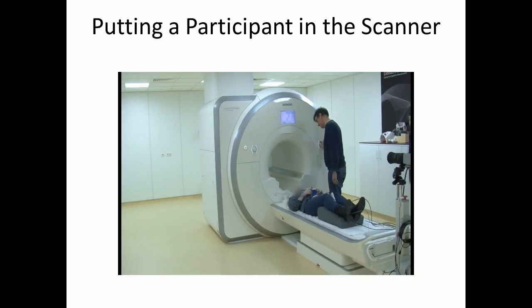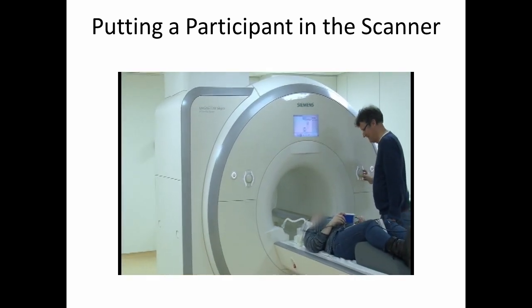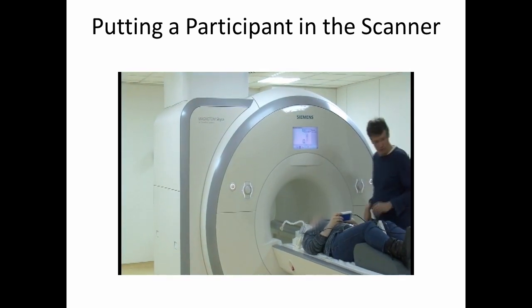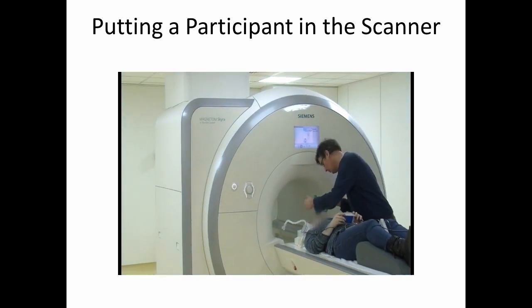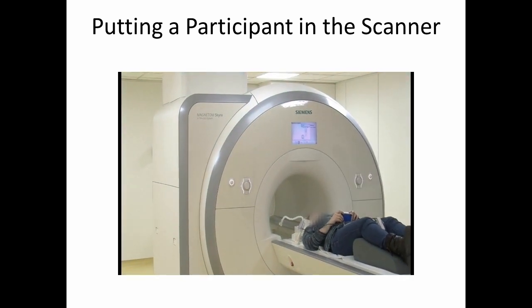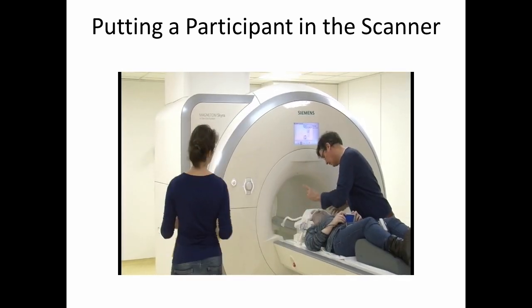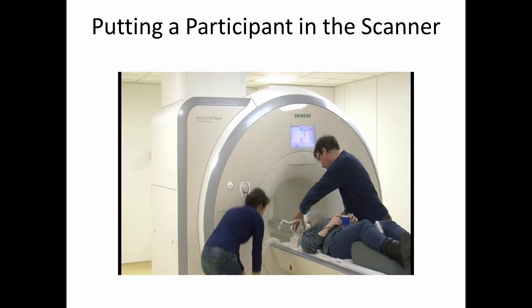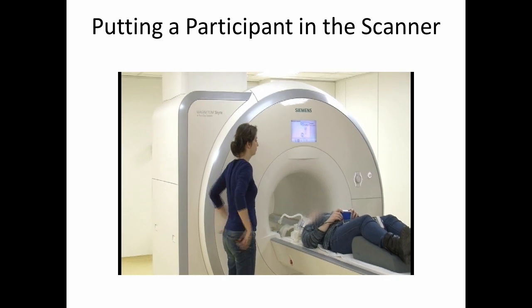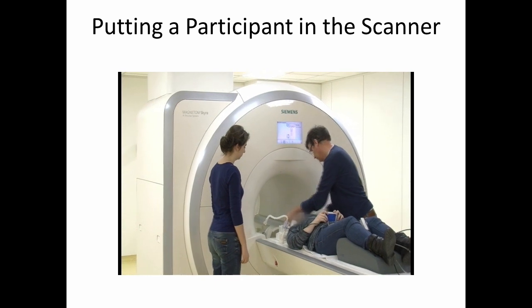In the following video, you'll see us putting a participant into the scanner. The participant is already lying down on the bed, and you can see that there's a cushion underneath their legs, which is there to make sure that they stay comfortable. They'll be lying in the scanner for somewhere around an hour and a half. In their hand is a button box that they'll use to respond to the stimuli we present them. One of the technicians is putting padding behind the participant's head to make sure that they can be comfortable. Over their head now is the radio frequency coil, which will be used to send and receive signals during the scan.